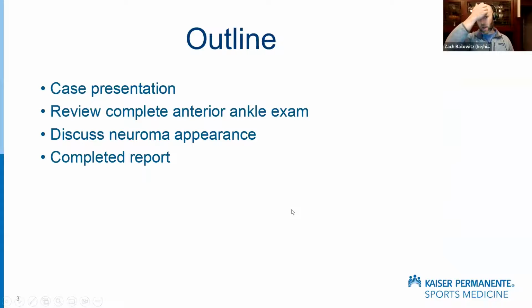So today we're going to talk about the case presentation. Then we'll review a complete anterior ankle exam. And then we'll discuss what nerve entrapment and neuroma can look like, and then talk about our completed report.